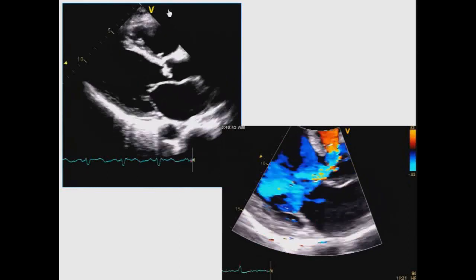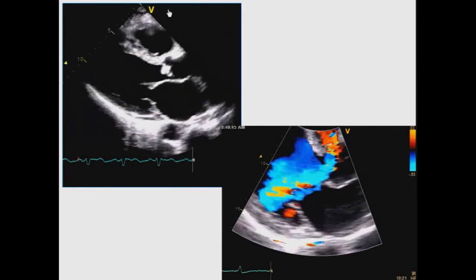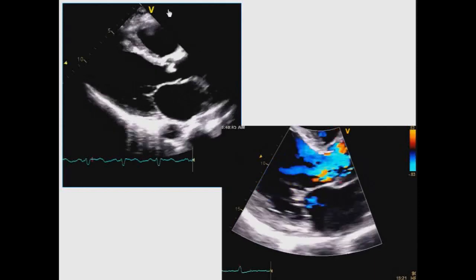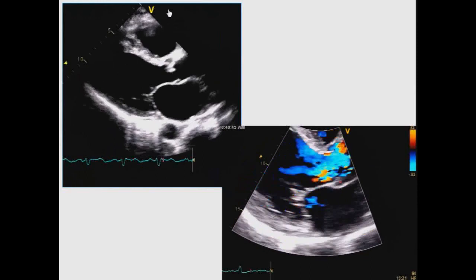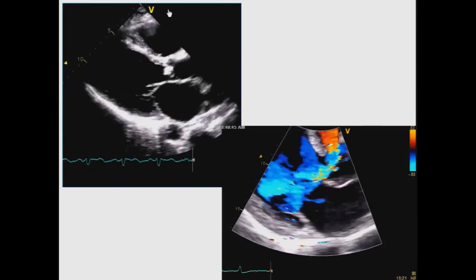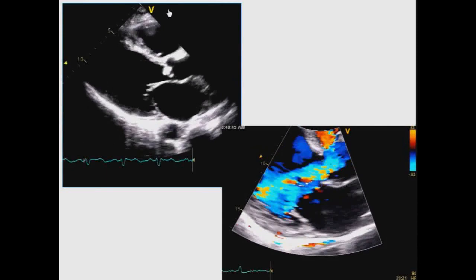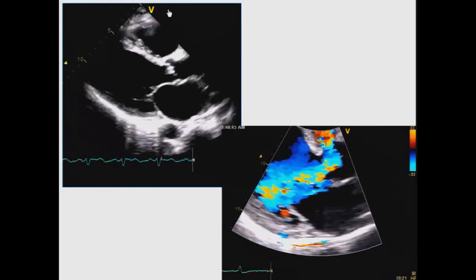When you have severe mitral regurgitation, the ventricle empties prematurely, and therefore you have premature closure. If you listen to patients like this, they have wide splitting of the second heart sound, but this is wide because the aortic component moves earlier. So this is a marker of severe mitral regurgitation. If you want to look at it in M-mode, you definitely can do that.